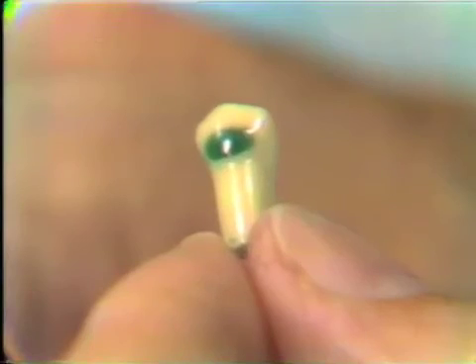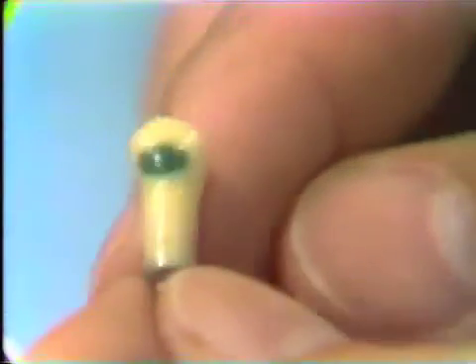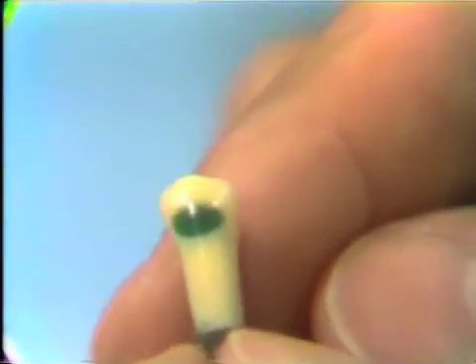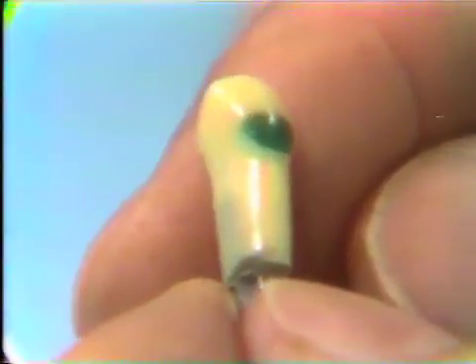When you have completed the wax freehand with the tooth out of the typodont, then you should examine it closely and make sure the contour, occlusal-cervically and mesial-distally, follows that of the tooth.